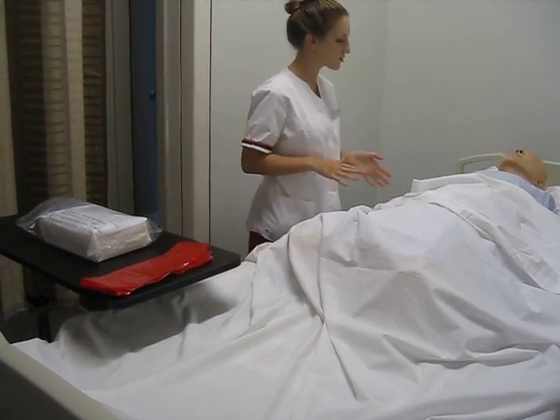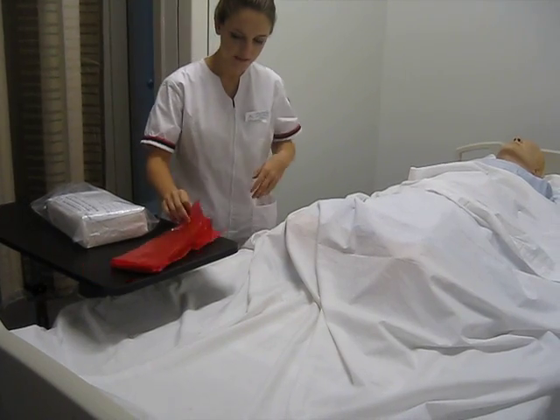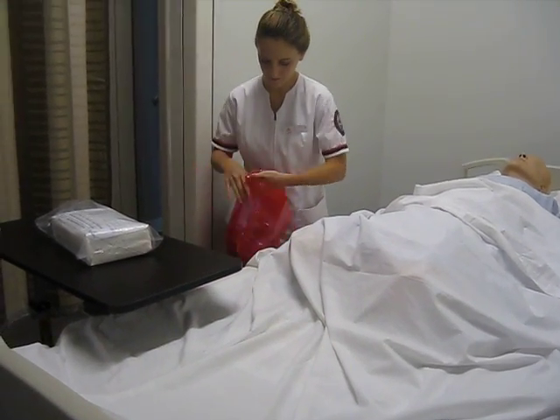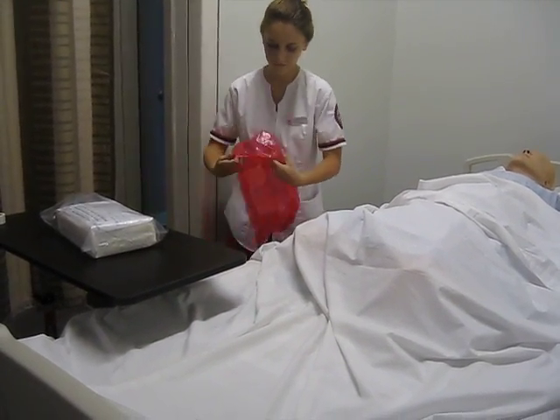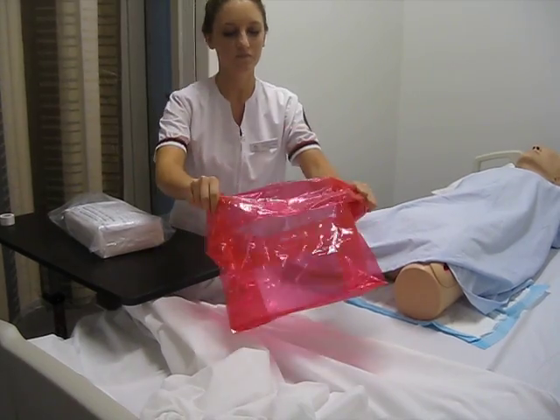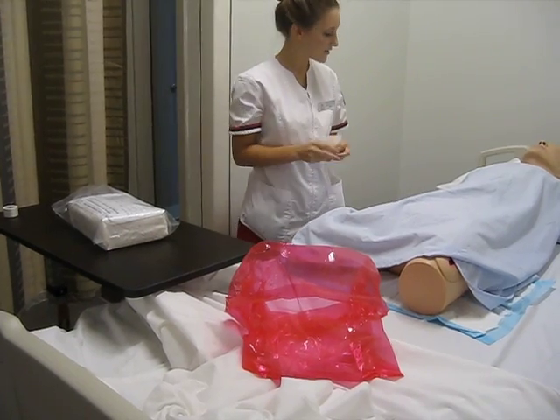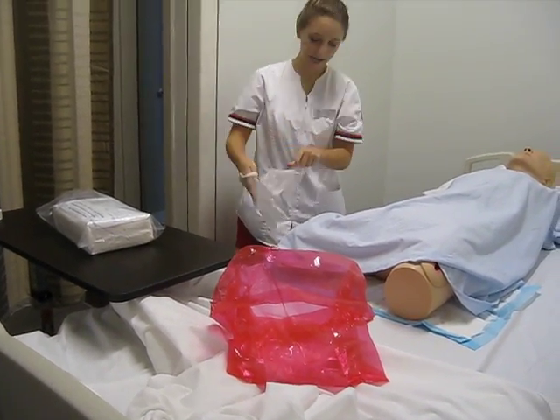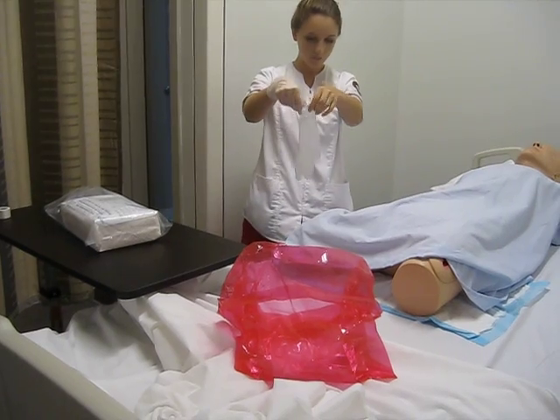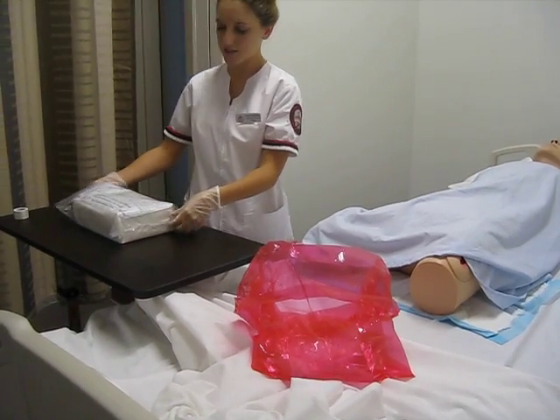Now we are going to be doing a catheter, and I will try to keep you covered as much as possible. I'm going to go ahead and set up my biohazard bag. So how are you doing today, Ms. Amy? That's great. When I insert this catheter, you should feel pressure but no pain. If you do feel any pain during this procedure, just let me know.